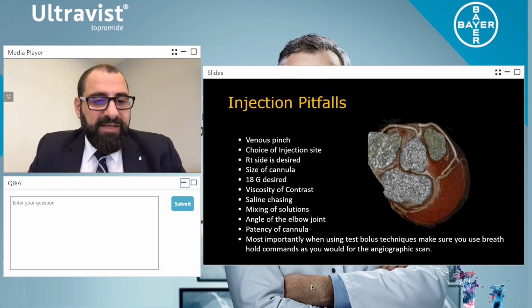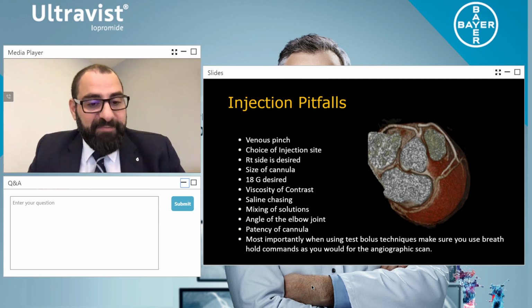And so what happens is, because you have a dense organ, this is why it's more important to have denser contrast. And this denser contrast allows you to see that large differentiation between the background parenchyma. So Sarah, that was a fantastic question. And this is the biggest issue that we're facing.